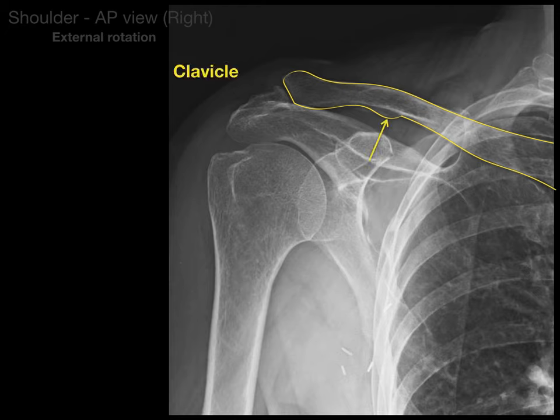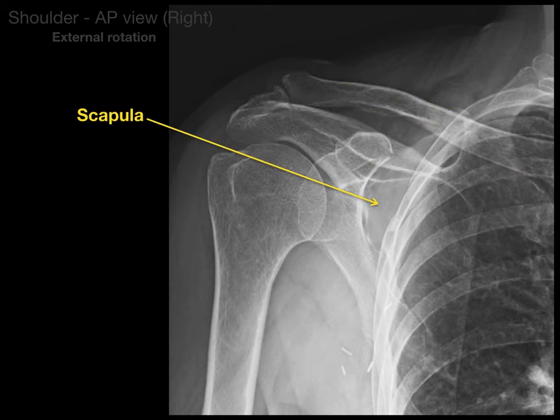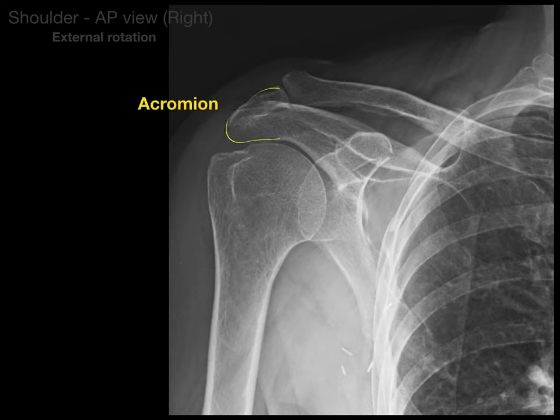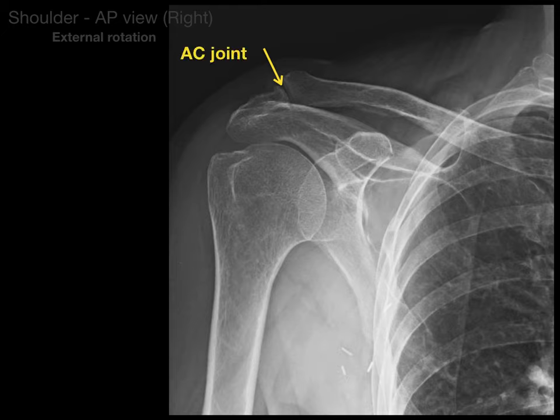That little landmark at the bottom is called the conoid tubercle. Next is the scapula. The acromion forms the point of the shoulder — like the acropolis at the point of a mountain. And the joint between the acromion and the clavicle is called the acromioclavicular joint, or AC joint for short.